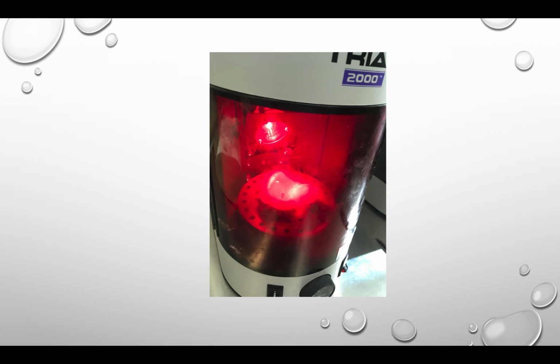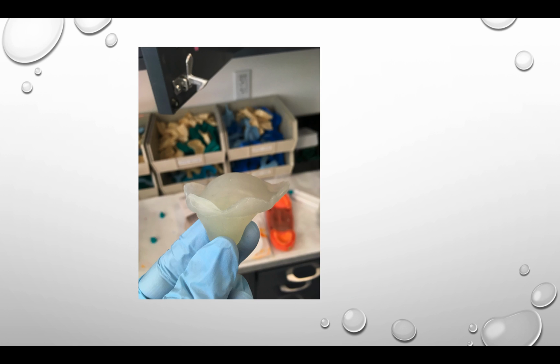You want to cure the Triad acrylic on the stone model for one complete turn in the cure machine. Once it's gone over one complete turn, you take it out, take the custom tray off the stone, put it back on the stone, and then put it back into the machine and let it cure for 1 minute. We do this so that the acrylic doesn't adhere to the stone and that you can easily take it on and off. Once you cure it, we have our custom tray.